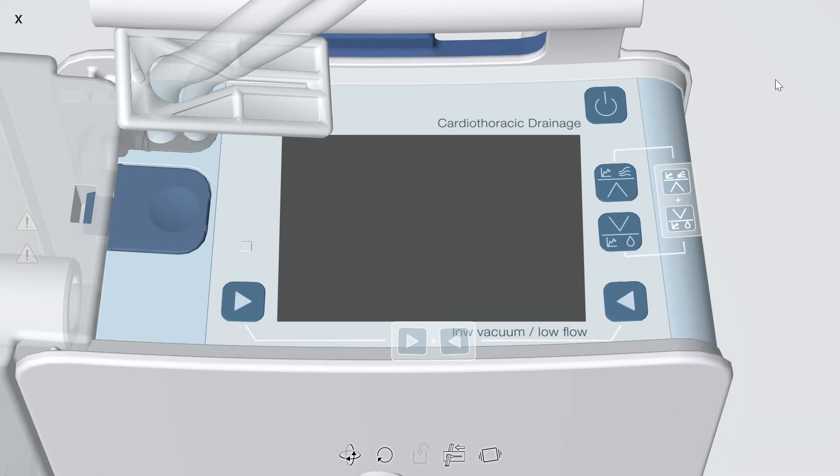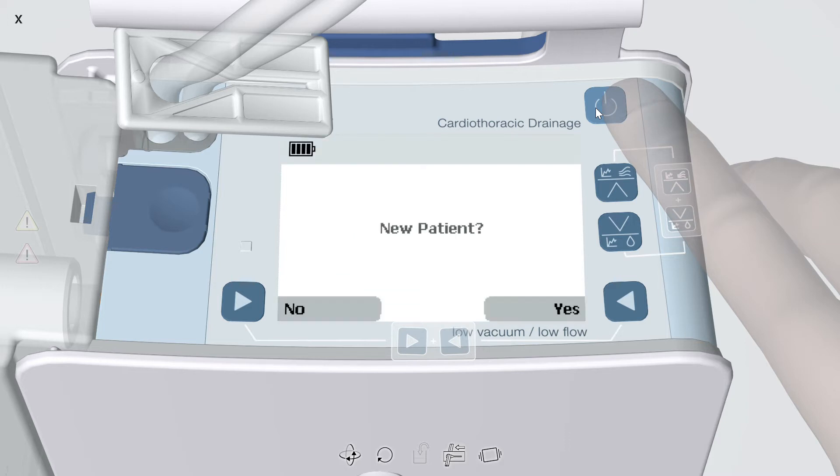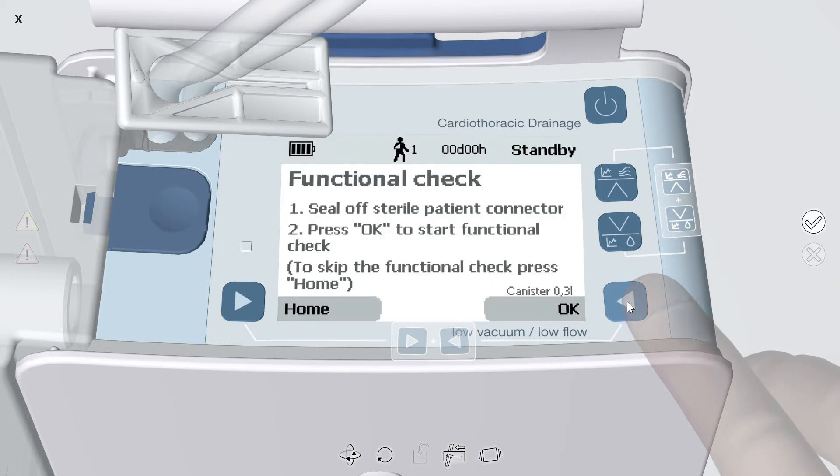To power on the device, press the upper right power button. This will power on the device but not initiate therapy. After a diagnostic check, Topaz Plus will ask if this patient is new to Topaz Plus therapy or not — press the applicable button. Pressing yes will issue a new patient number and time and history data will start at zero. Pressing yes will also take you to a functional check.